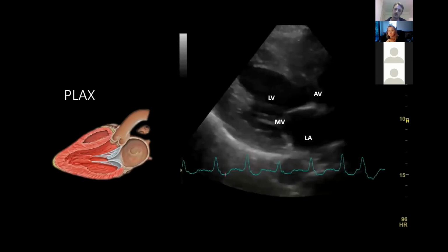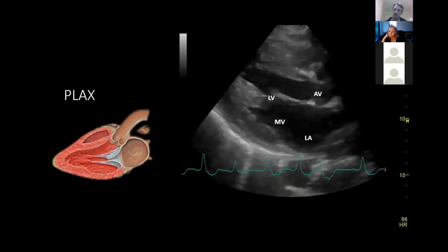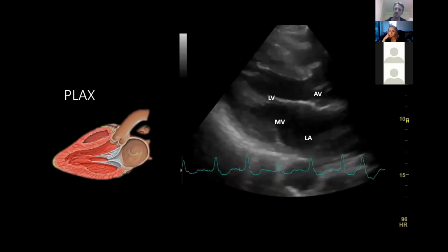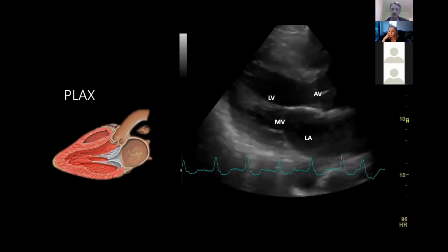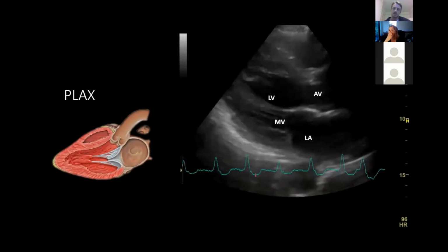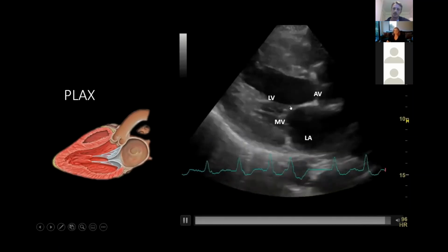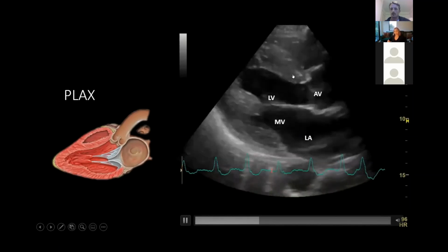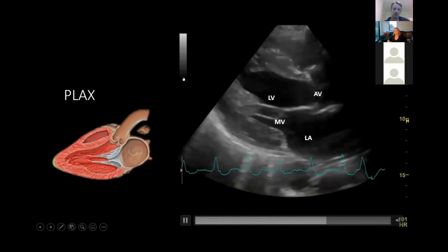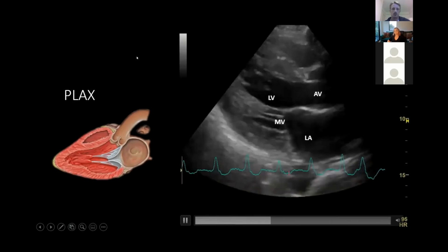If the room is emptied of people, you can open the door, which is the mitral valve. The door can swing right into the room easily. But if hardly any people leave the room, then the door can hardly open at all. And that's what happens. I don't know if you'll see my mouse, but up at the mitral valve, when it comes up, it should come up nicely to slap the interventricular septum, which is at the top closer to your probe.